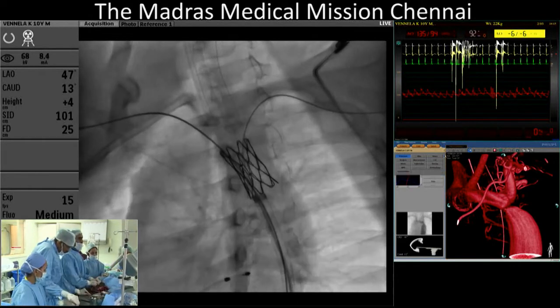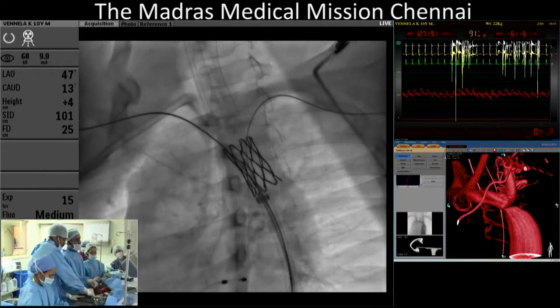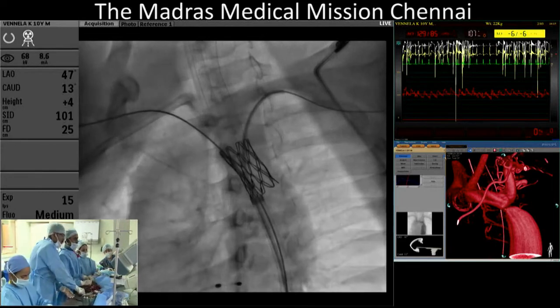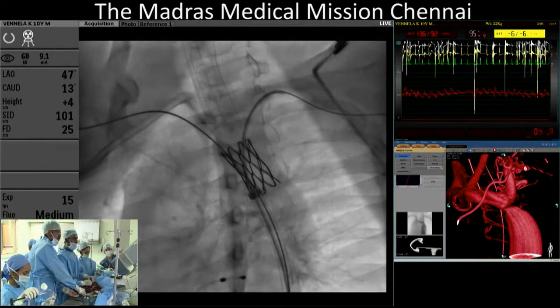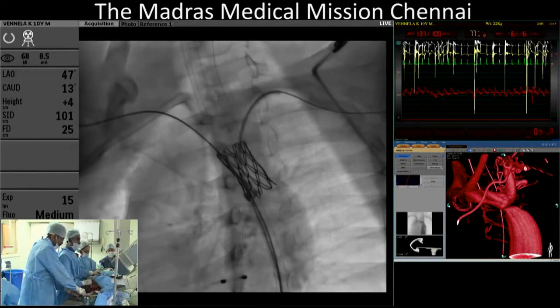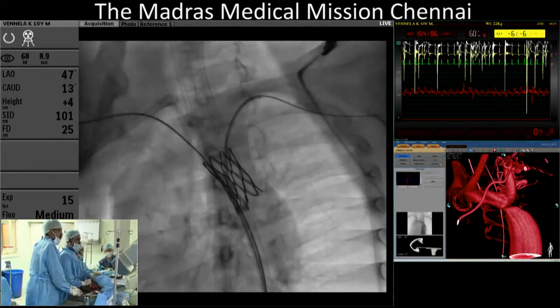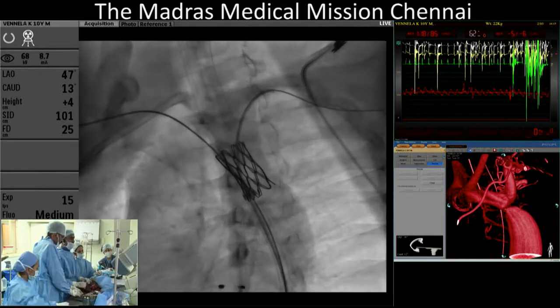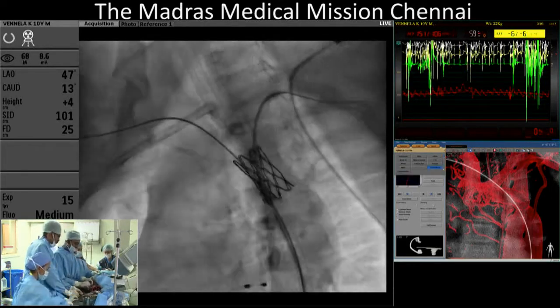So what are you going to do now? I'm going to get the side arm of the sheath advanced a little bit through the coarctation and make an angiography. I'll see whether I can get it coaxial and go across. We saw that the post-coarctation aorta was a very roomy chamber, and so now the sheath has to go across. Can you give a pigtail across here?